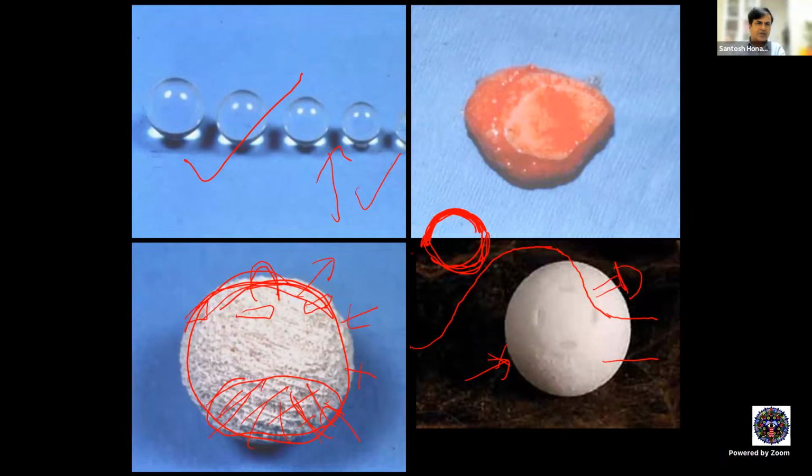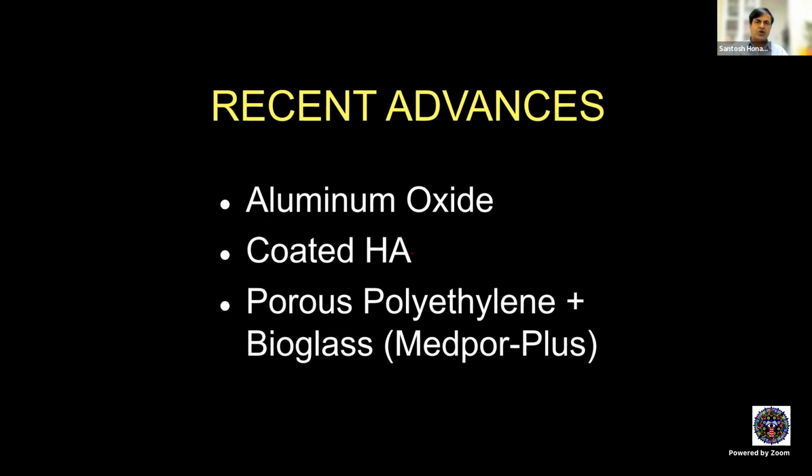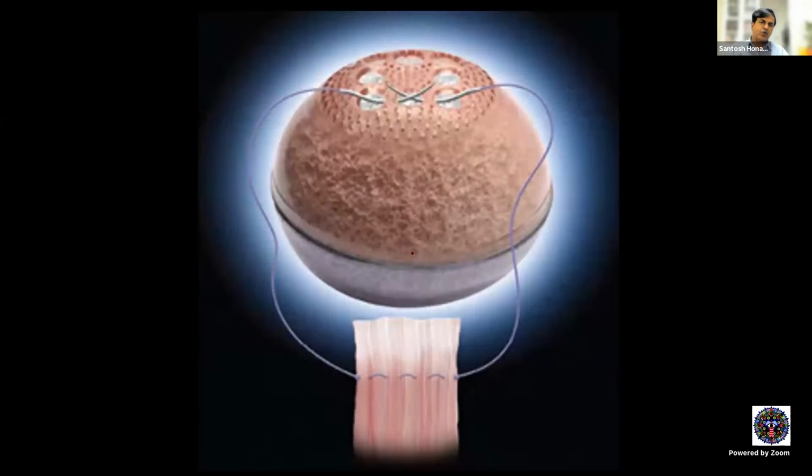Anterior Tenon's, etc., will get stuck to the implant and get dragged because it has a rough surface. It is like stabbing something with something which has a very rough surface. It will drag tissue. It will cause a kind of trauma. So to prevent that, you need a smoother surface. That's called coating. And this is how a coated hydroxyapatite looks. You see this anterior coating. This is going to be there for a long time.